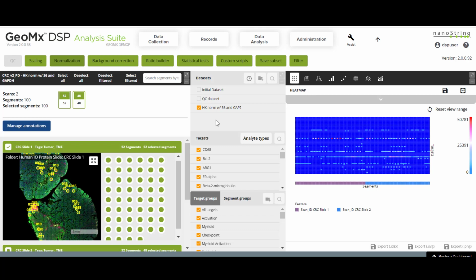To determine specifically which antibodies to use for a given strategy, please study the pairwise plots presented with your own data.